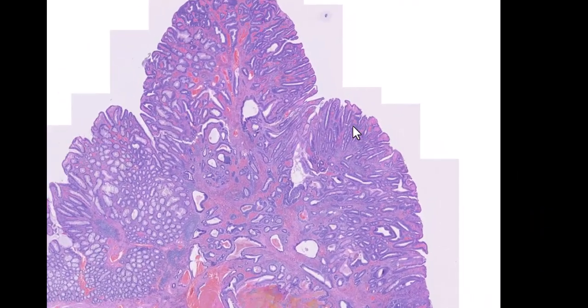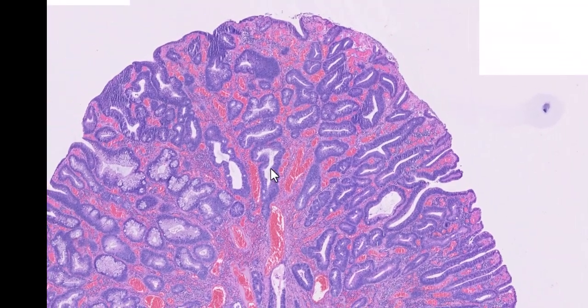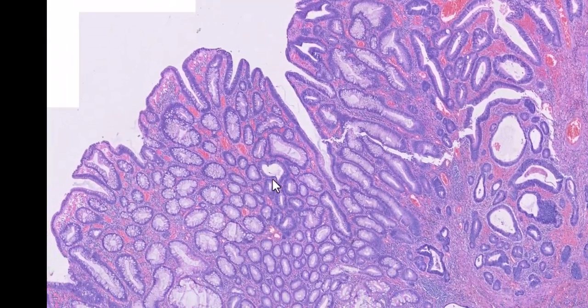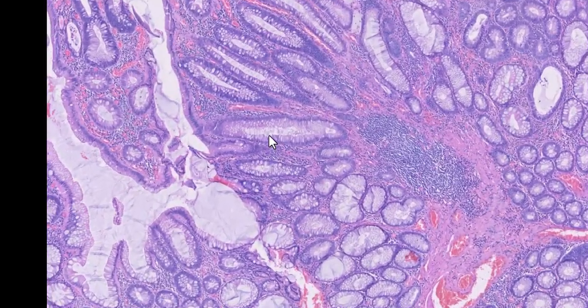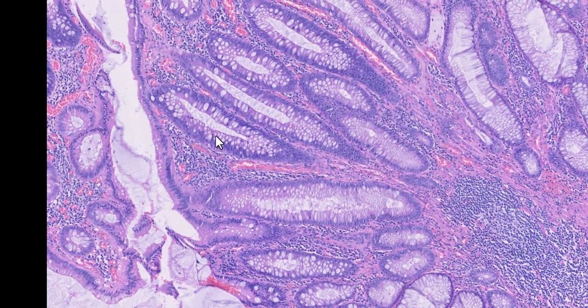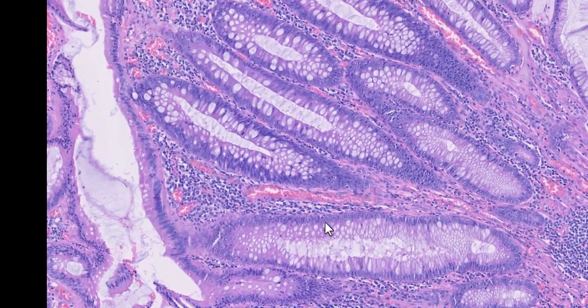Let's go all the way to the very top of the polyp. We talked a little bit about this in case 5. This is an adenoma. Why is this an adenoma? Because the cells are tall, dark, and hyperchromatic. Tall, dark, and hyperchromatic compared to what? And here is the adenoma here. There's some apoptotic activity. And compared to the adjacent normal mucosa, these are tall, dark, and hyperchromatic.